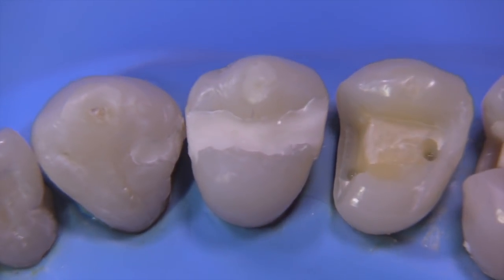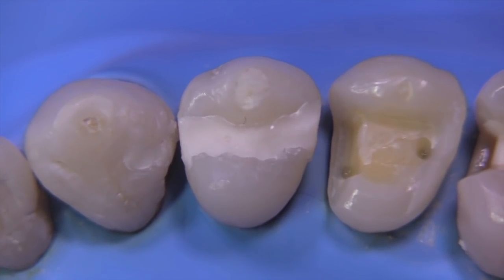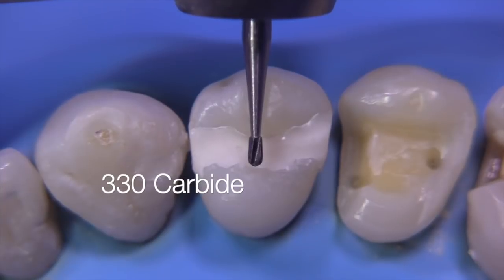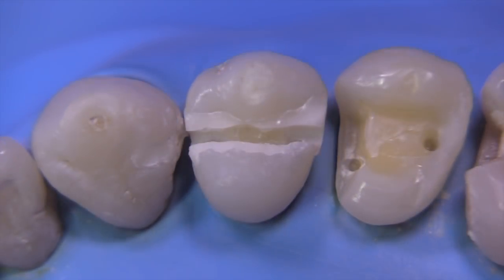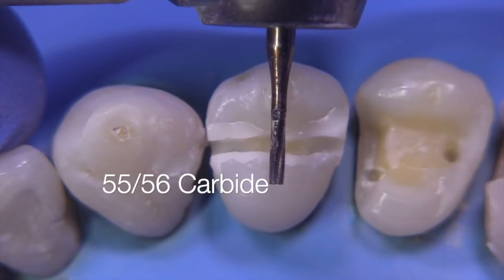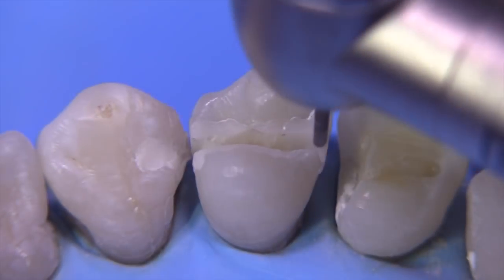Like all of the procedures that we do for castings, after we've blocked out and we have anatomy that's pretty much like the tooth in terms of its contours, we're going to go ahead and start with the 330 burr and make a little slit. After this slit is made, this gives us our 1.5 millimeter depth cut. We can now work on getting this to draw, utilizing a small carbide, straight carbide, like a 55 or 56.